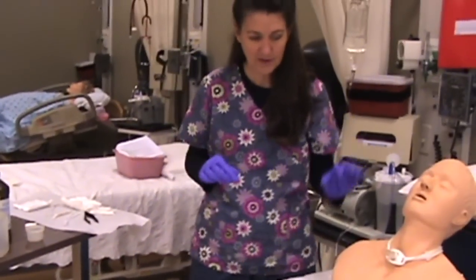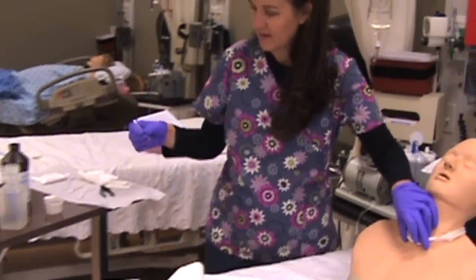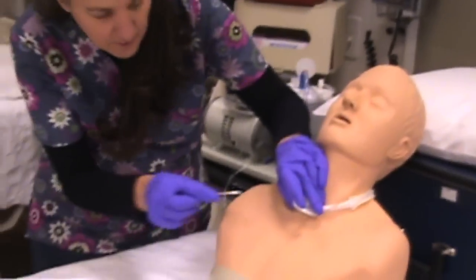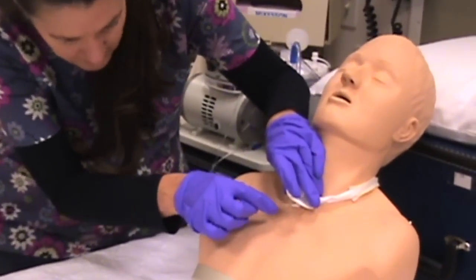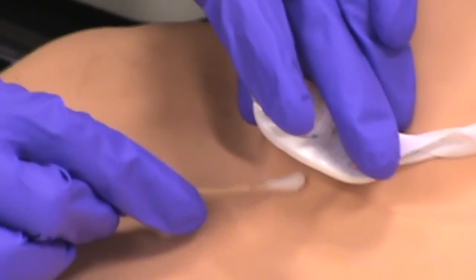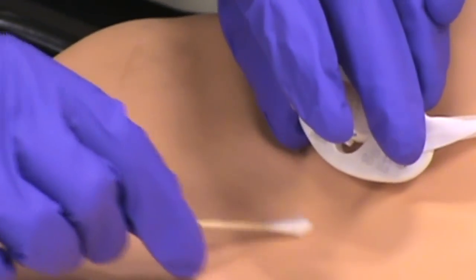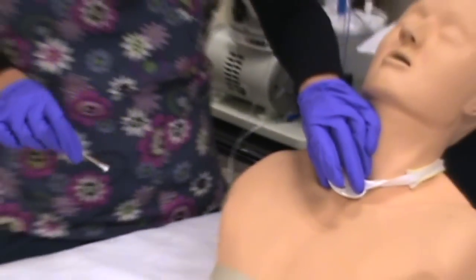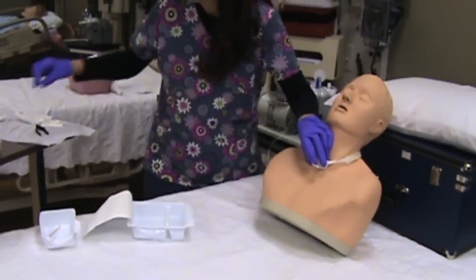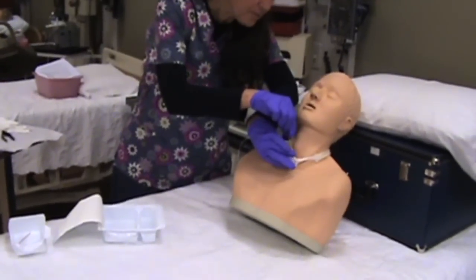This is my dirty hand, so I'll start with the outside right here. I'm going to take some peroxide and put it on my Q-tip. Let's say it's a little bit crusty up near the opening, so I'm going to swab from inner to outer, and I can rotate the Q-tip. Then I want to pull it around my sterile field and put it in the trash. I can also do that with the peroxide on the top.